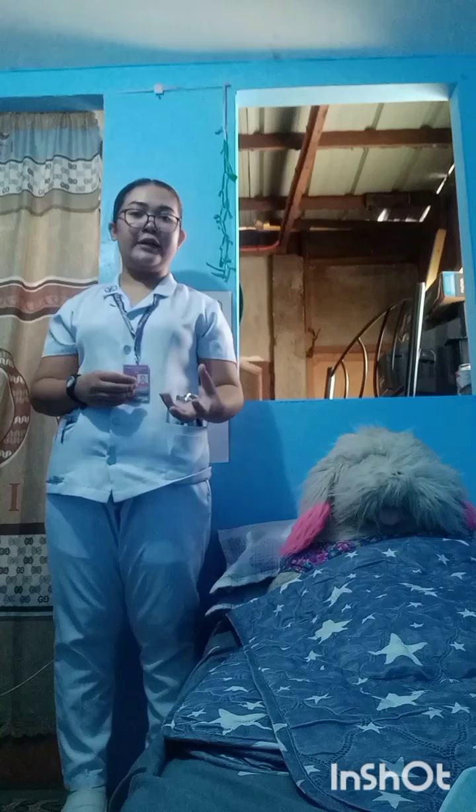The first procedure is we need to determine the need for oxygen therapy and verify the order of the therapy. Why? Because verifying before giving oxygen therapy will prevent any medical error. So you're going to look for the doctor's order in your yellow chart or chart for the order of the doctor for administering any therapy for our client.